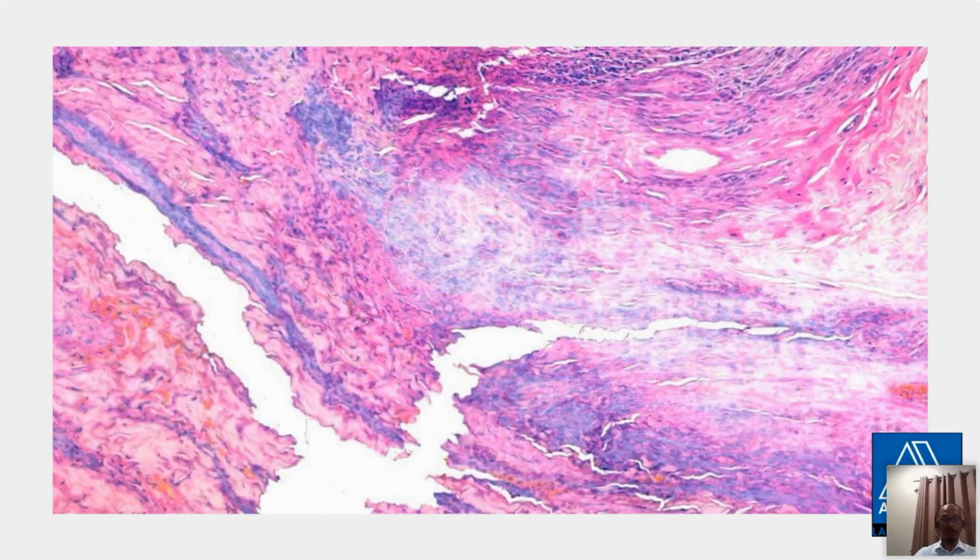Because clinically, the top part will look like a keratoacanthoma, even clinically, the lesion will look like keratoacanthoma. However, on histology, you'll find that the upper parts do look like keratoacanthoma, while the deeper parts show poor differentiation. So in this particular case, one couldn't say whether this is just keratoacanthoma or is it some keratoacanthoma-like poorly differentiated squamous cell carcinoma.